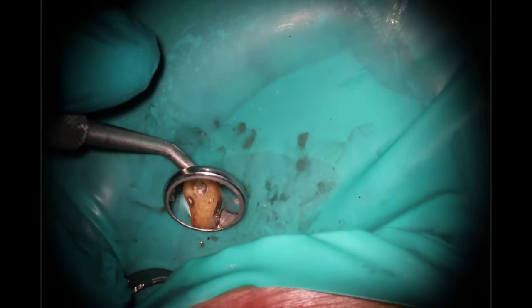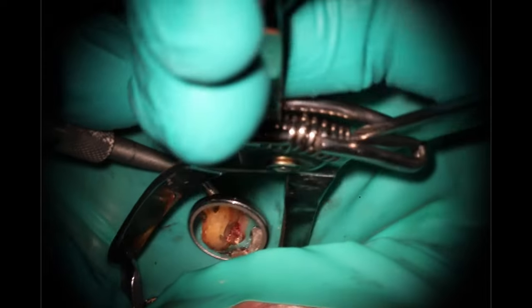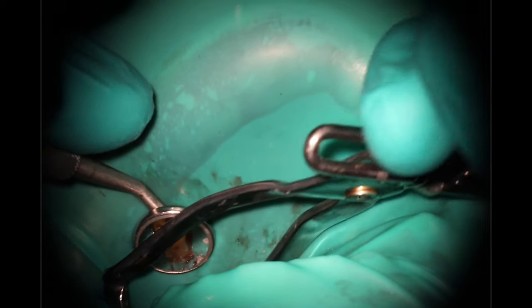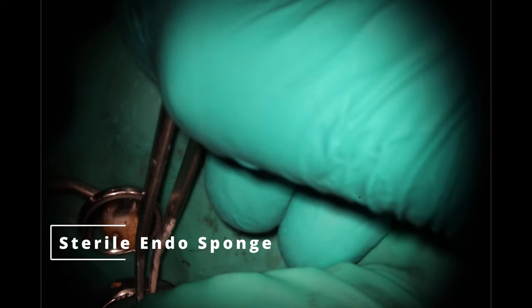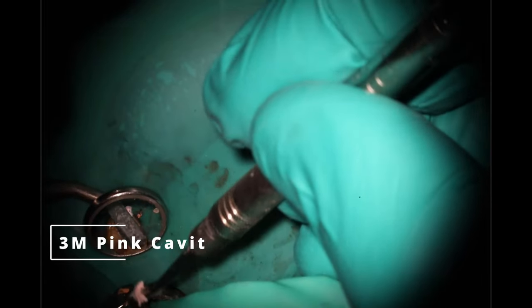You can see the curve on the MB, hence why I had to do a little bit more work. So what I'm trying to do here is figure out how I'm going to temporize this. Normally if it's a regular case, I have my assistant do it because it's pretty straightforward. However in this case, the occlusal aspect over the buccals is very straightforward — sponge and cavit, call it a day. But at this point, I'm trying to figure out what I'm going to do to seal up that palatal and make sure that it's protected. One thing: do not use cotton pellets — they are absolutely awful. If you want your referrals to love you, use an endo sponge. We take endo sponge, chop it up using a blade, sterilize them, and keep small little pieces together — that's what we use underneath the cavit.